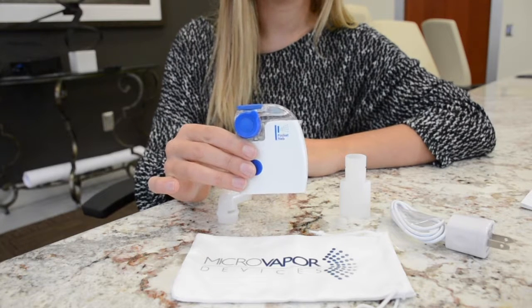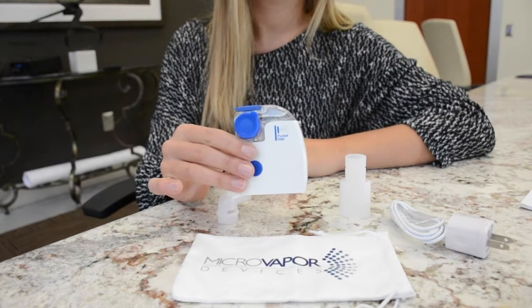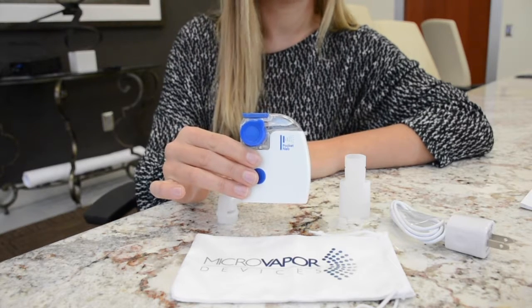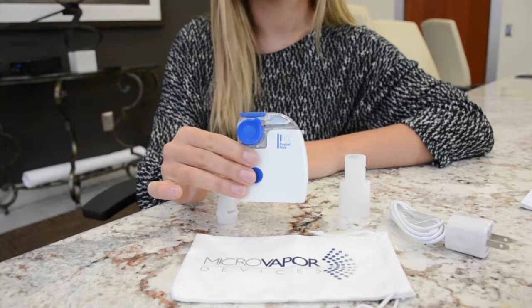But at my last visit to the doctor they introduced me to a new device called the Pocket Nub. It's a small handheld portable nebulizer that works electronically. This device uses a rechargeable battery that lasts for over 60 minutes on a charge, and what I really like about it is that it delivers my treatment in about 7 minutes and delivers all the medication, unlike the nebulizer I was using before.